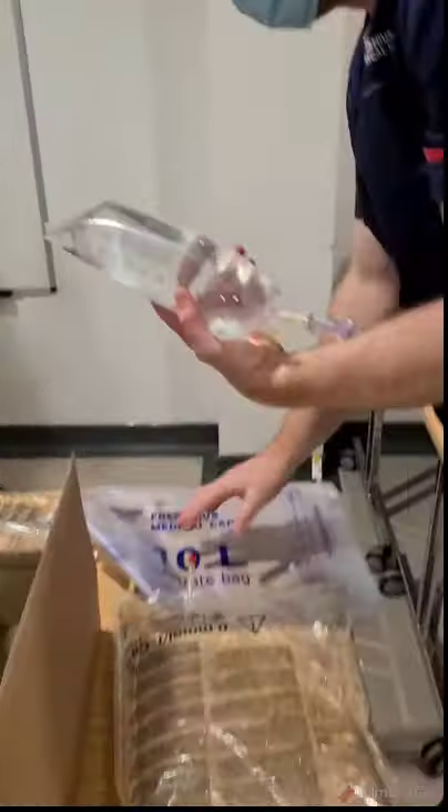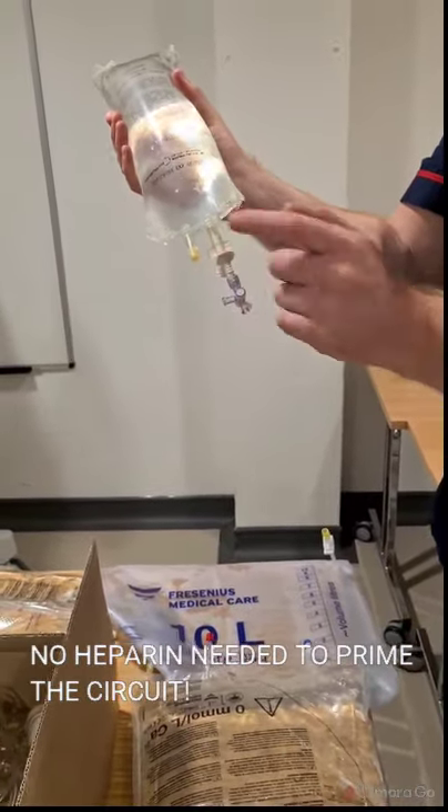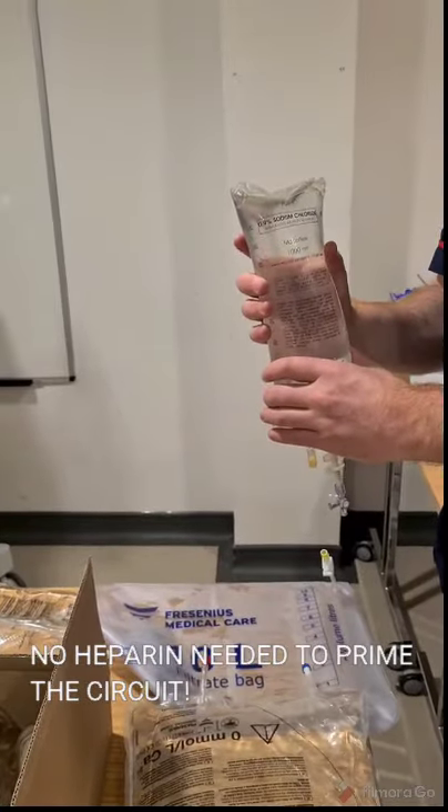We'll have a one-liter bag of just normal saline, no heparin added. I've already attached this bag and a three-way tap to that. So that's no heparin for the saline.